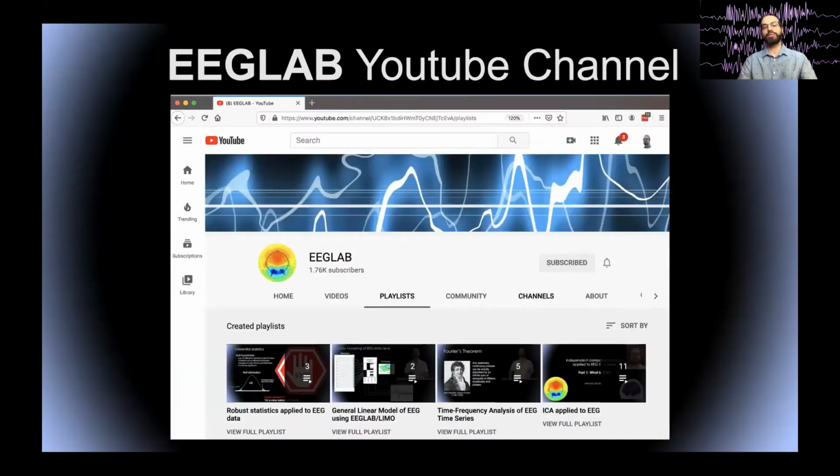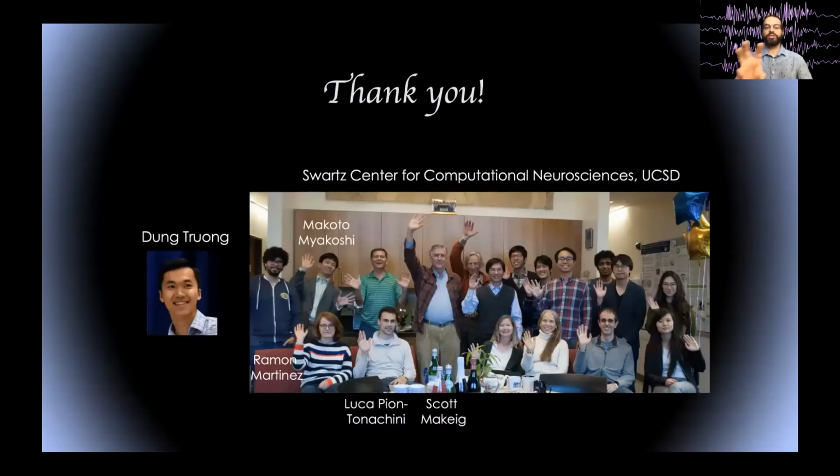I mentioned several times our EEGLAB YouTube channel, in which we have lots of tutorial videos. We also have the EEGLAB tutorial with more like 300 web pages of step-by-step instructions to analyze your data. And so this is the first part, and now I'm going to move to the NSG part.